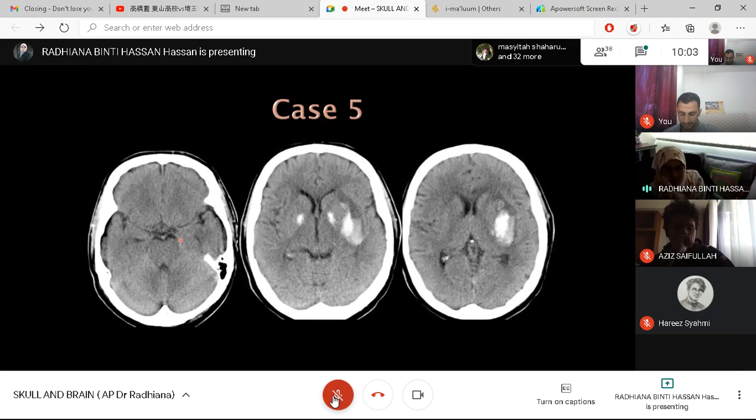So, for the description of findings, you have to describe first before you give a diagnosis.